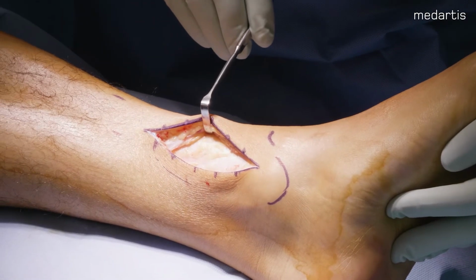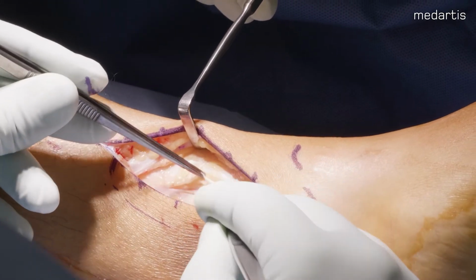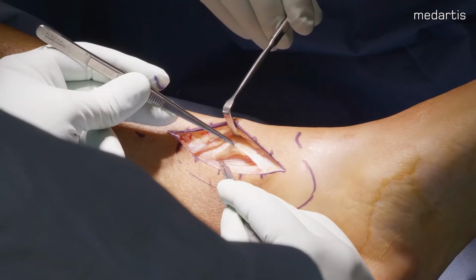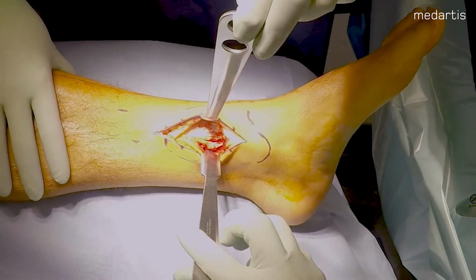At the level of the tibial supramalleolar flattening, the periosteal flaps are elevated with sharp dissections. A periosteal elevator is used to ensure access to the tibial cortices. Homan retractors are then inserted to protect structures anteriorly and posteriorly, such as the posterior tibial neurovascular bundle.